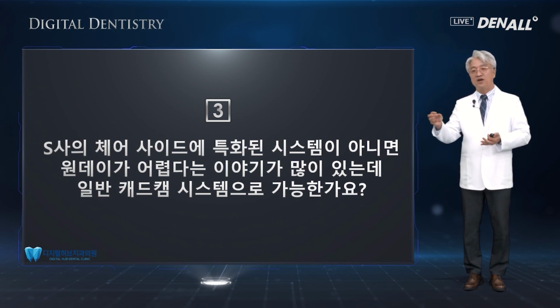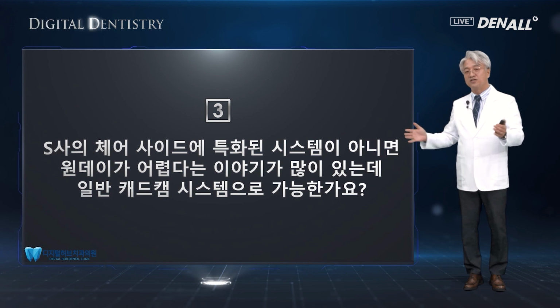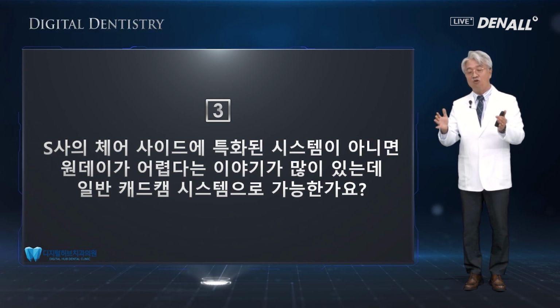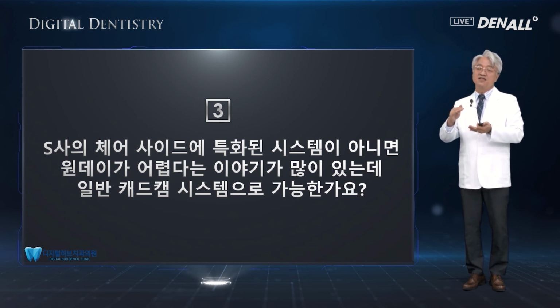And using a general CAD-CAM system to do the one-day approach was not attractive because it took a lot of effort and time. But with the 3Shape and SCAD and other milling machine devices and OSSTEM's 3D printers or OSSTEM's milling machine devices, if you use them, then time-wise you can really shorten it a lot, and it's very economic and it's very precise.